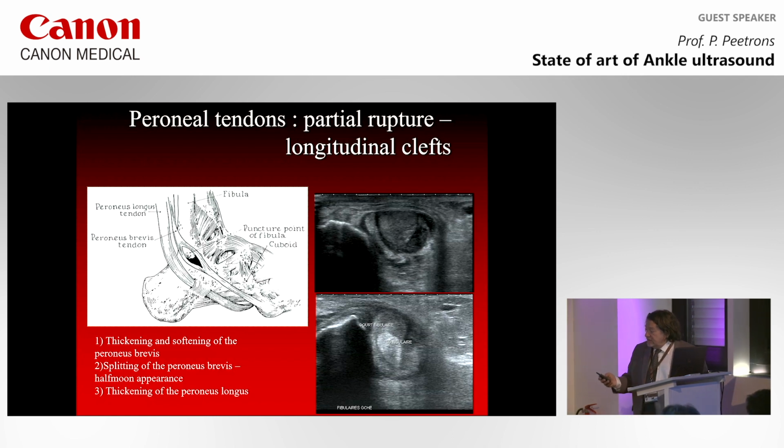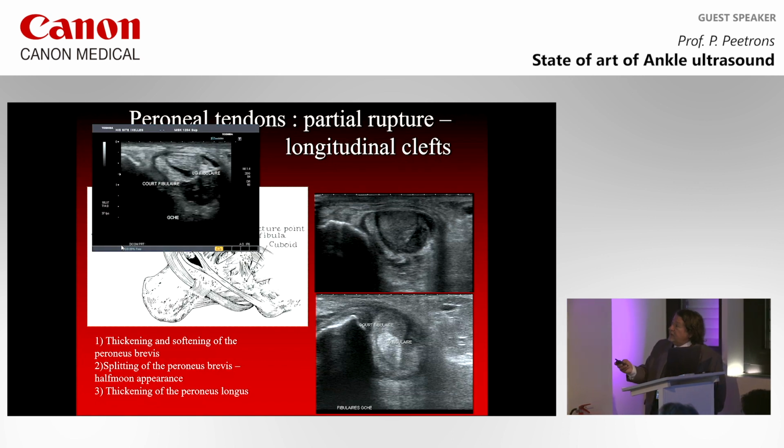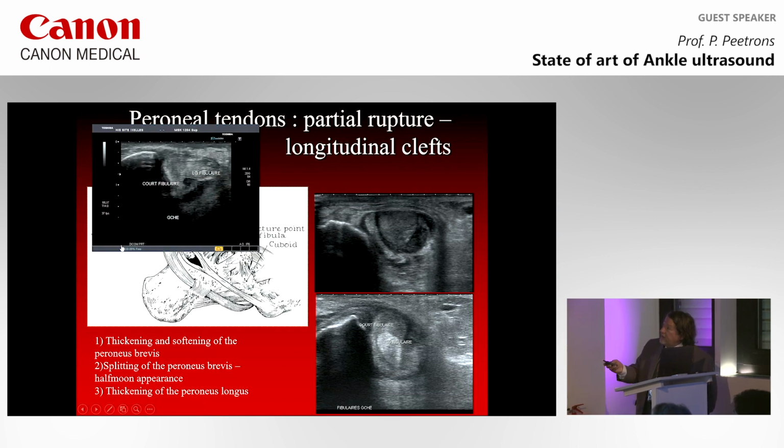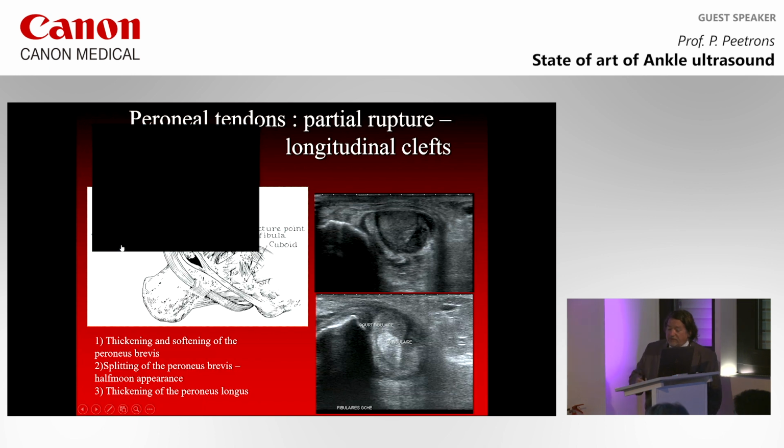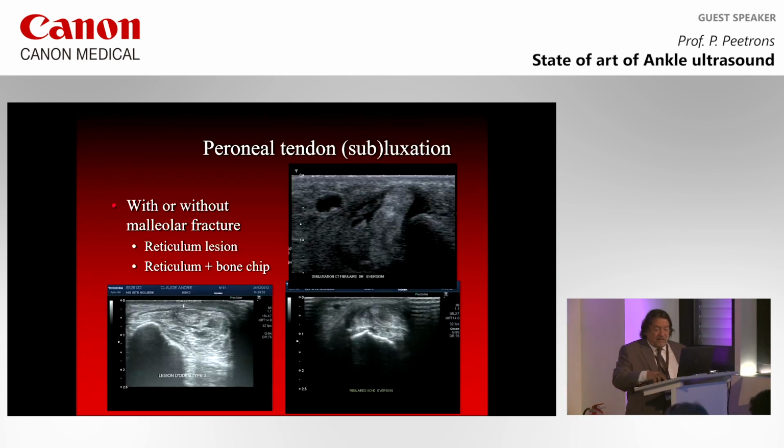So don't forget this boomerang image or the circular image of the peroneus brevis around the peroneus longus, which is abnormal in every case. This is an example here that you can see in this short video. Peroneus longus is on the top, peroneus brevis is here, and you can see that peroneus longus is going inside, and then after, just in the submalleolar space, you see the cleft inside the peroneus brevis. So the cleft is about to come when you see these lesions of the peroneus brevis.